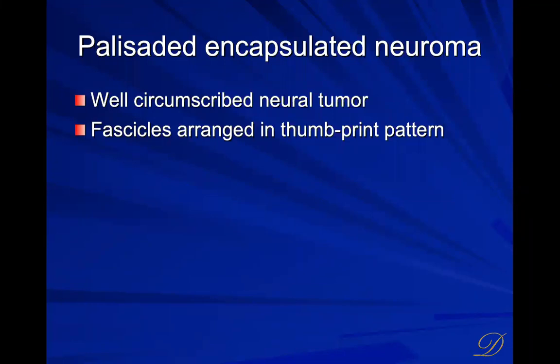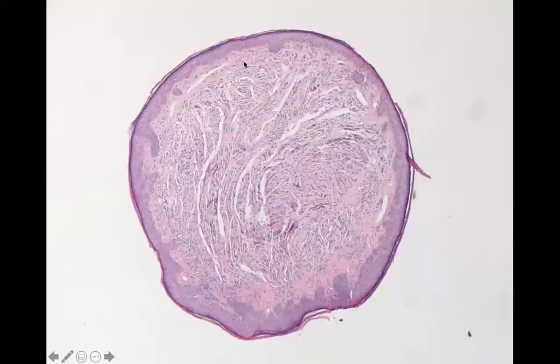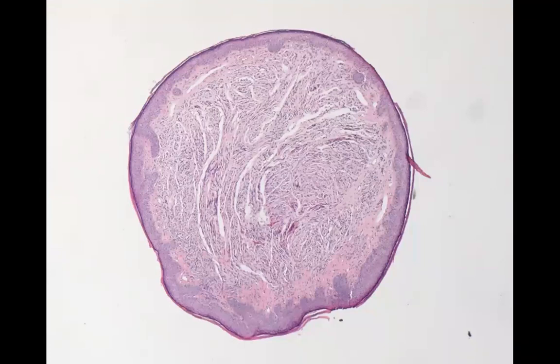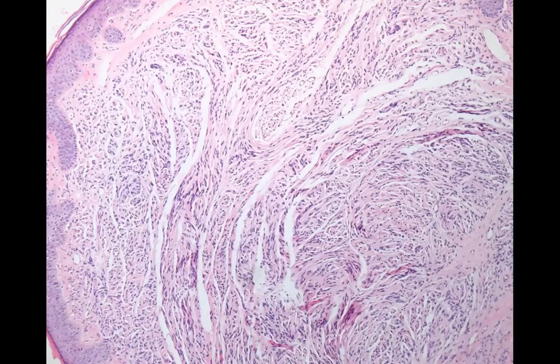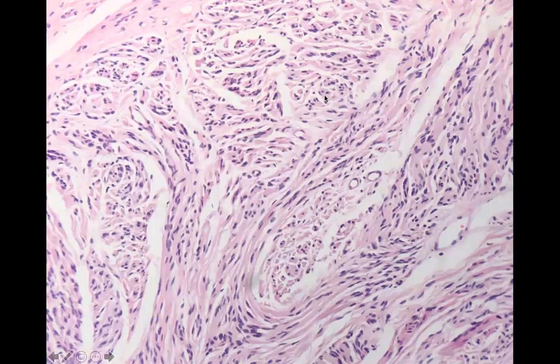Palisade encapsulated neuroma is a benign tumor-like proliferation of more mature nerve bundles. It's well circumscribed and arranged in fascicles because mature nerves occur in fascicles, giving it a thumbprint pattern. Here we have a well-circumscribed nodule with clefts between the fascicles. You see pink wavy cytoplasm with tapered-ended nuclei — this is a palisade encapsulated neuroma, probably the most common type we see.